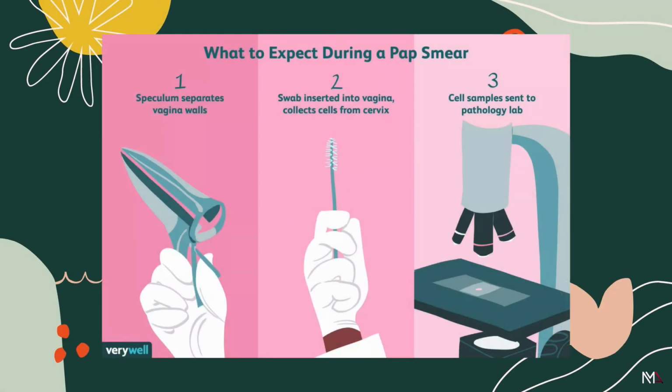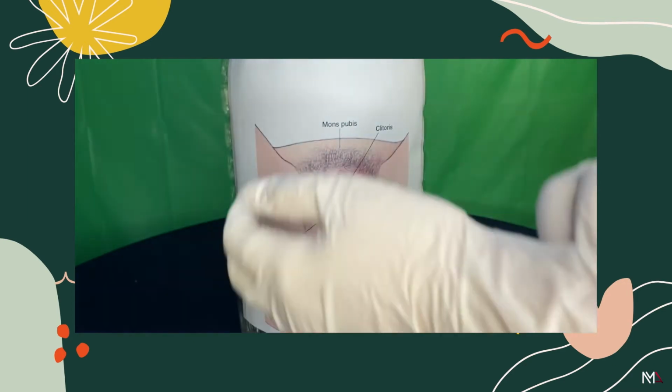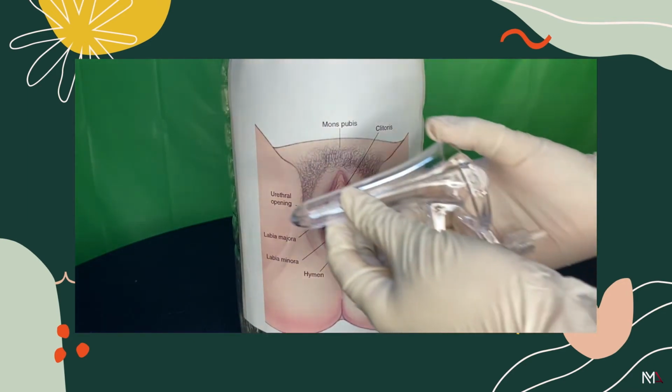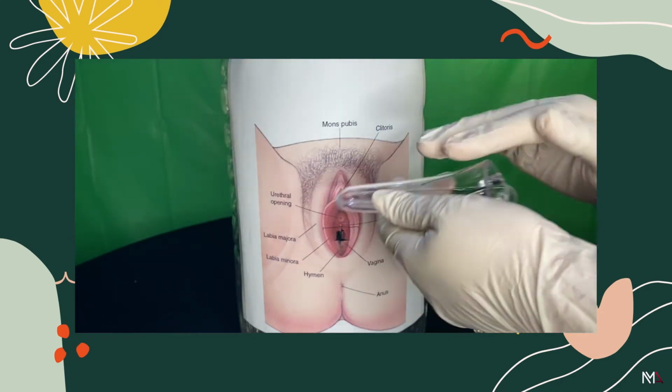How is pap smear performed? First, explain the procedure to the patient. Place the patient in a dorsal lithotomy position. Observe aseptic technique by putting on gloves. Choose the appropriate speculum for the patient. A water-based lubricating jelly may be applied to reduce friction caused by the speculum.